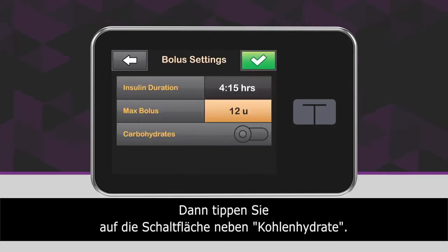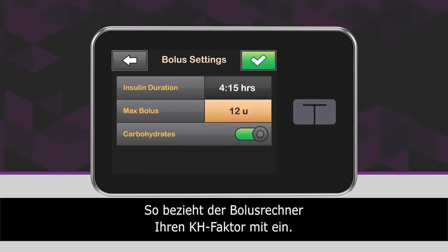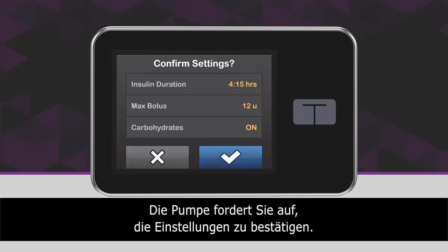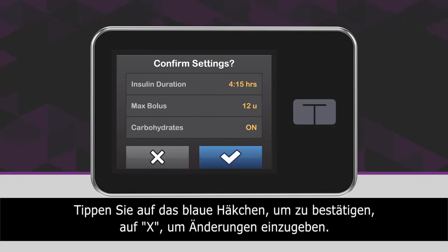Next, tap the carbohydrate slider to turn carbs on, meaning the bolus calculator will use your carb ratio when calculating boluses. Now, review all the values you entered and tap the green checkmark icon. The pump will then ask you to confirm your settings — tap the blue checkmark icon to confirm or the X icon to make changes.